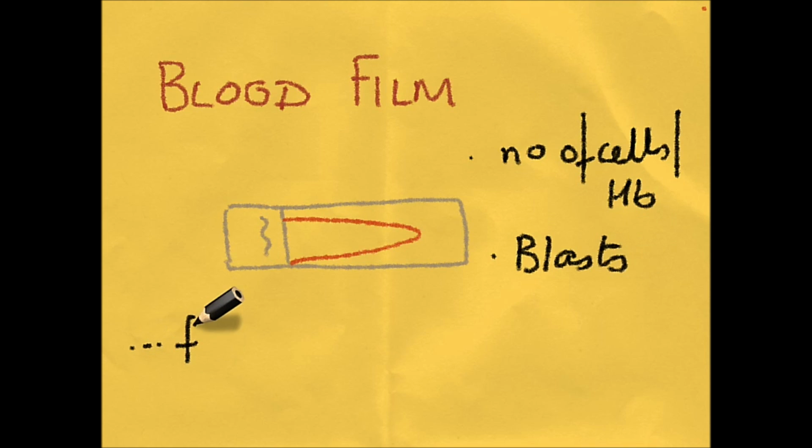Results which are outside of the normal range, or where there are cells that the analyzers are unable to identify, or if there are immature cells in a sample, the analyzer will flag the sample for a blood film. A biomedical scientist will review the results and decide if a blood film should be made. If a film is made, it's examined under a microscope, and a small proportion are sent through to the haematology doctors to add a medical comment.